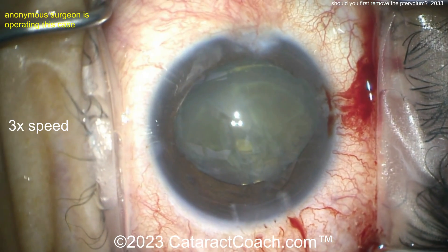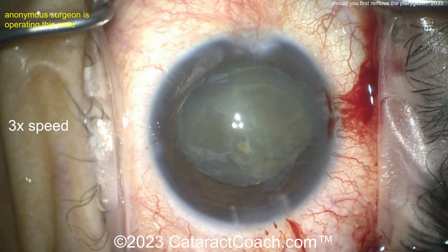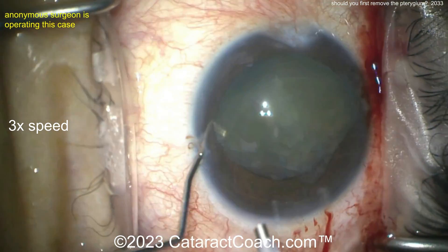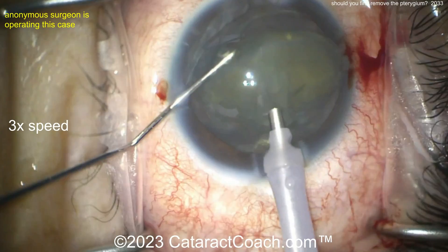A little viscoelastic added. Clearly there are two surgeons operating here — an attending and a resident, it looks like. Now we can see what appears to be a Nagahara chopper in the left hand and a phaco probe in the right hand. We'll watch the technique here from the young doctor.